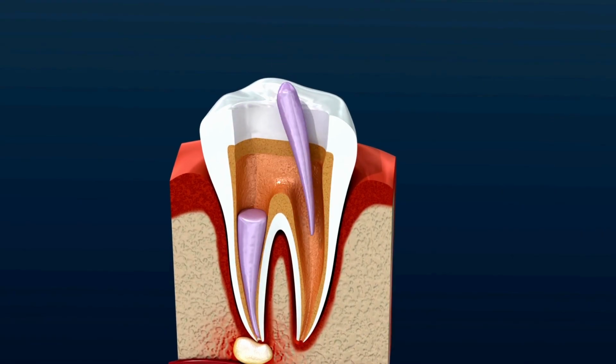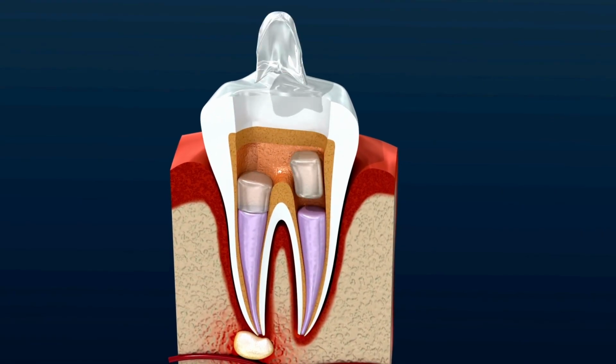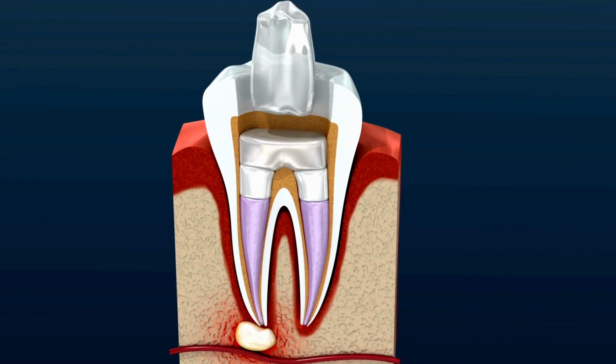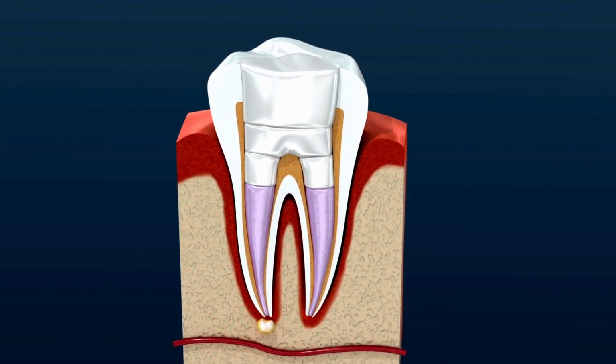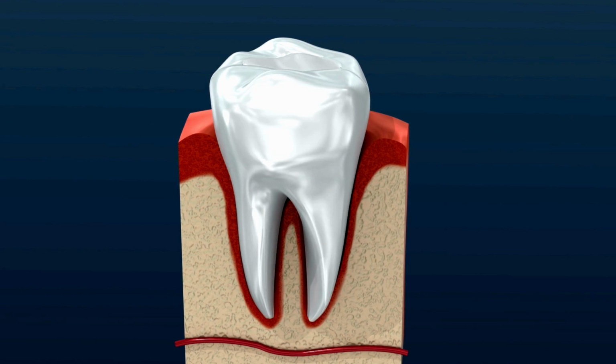After 2 weeks, we open the tooth back up again, and we fill it with a cement almost. And we use multiple layers of it, so that way bacteria is going to find it very difficult to get in the tooth again in the future. So that way the tooth stays clean inside, the infection stays away from the roots of the tooth, and we put a crown onto the tooth afterwards so the patient can function freely with the tooth.